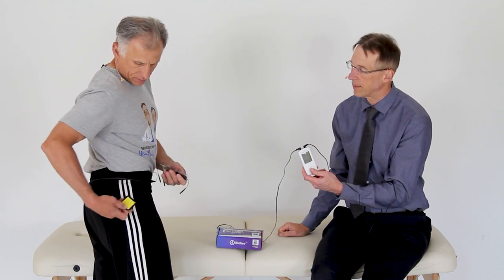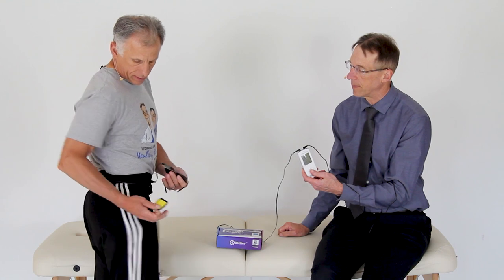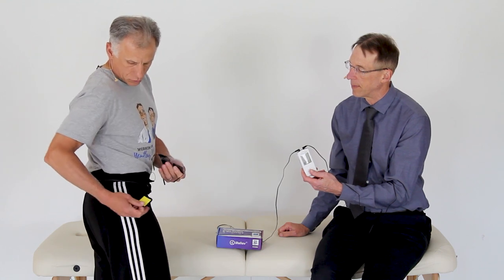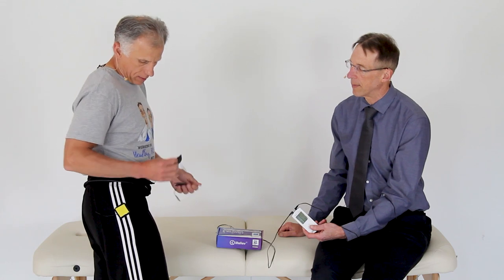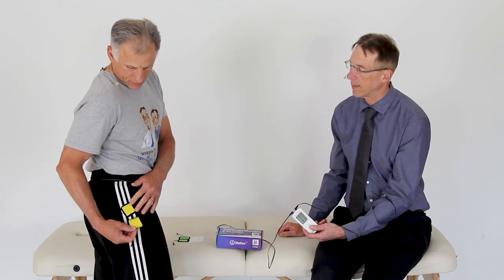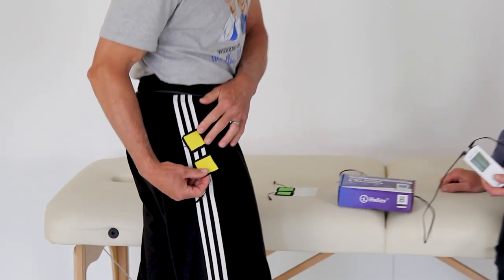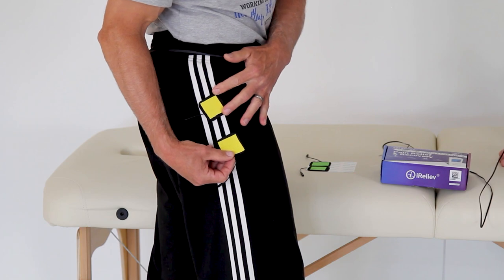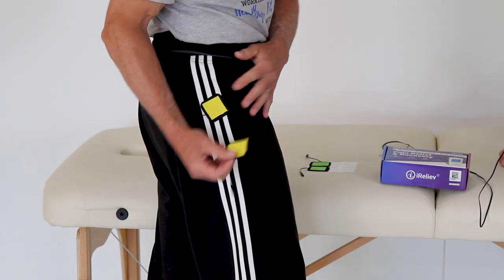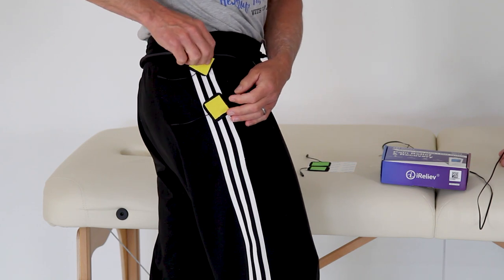Let's say the pain is right here. I'm going to start, and again, you're going to have to do trial and error. You may want to go right over the top of the pain, and then you may want to go below it. Just make sure the pads aren't close. If they're touching, that's way too close. Half inch is too close. You want to have the same distance as the width of a pad apart. So you can go down here. I could put it here. I could put it here. I could put it here.